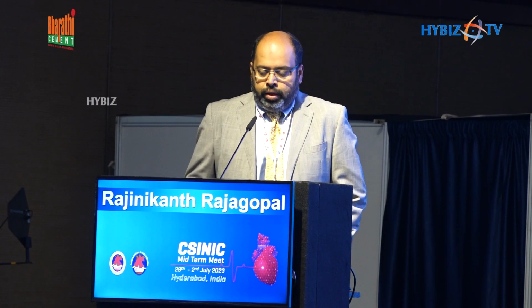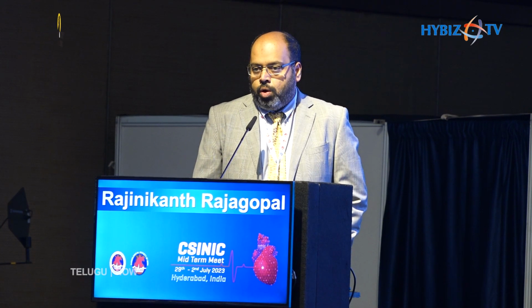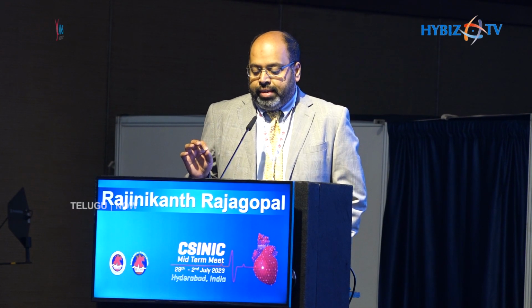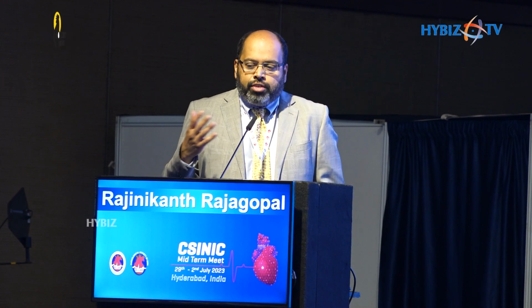Okay, so there. And it's not surprising, we know from a lot of studies now, from long-term follow-up and large trials, that imaging-guided PCI in de novo disease improves outcomes by improving our vessel preparation, stent sizing, and optimization. And if you think about ISR, all these mechanisms still work, but you literally have an extra layer. And that is the role of imaging in understanding the mechanism of failure, which will dictate our treatment.